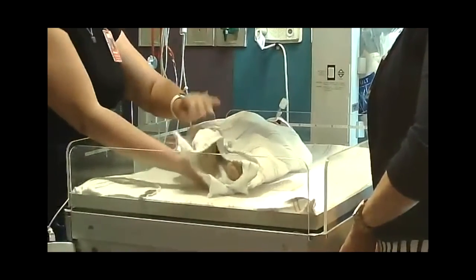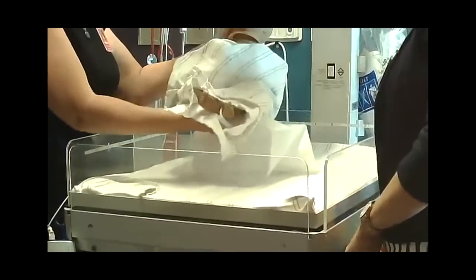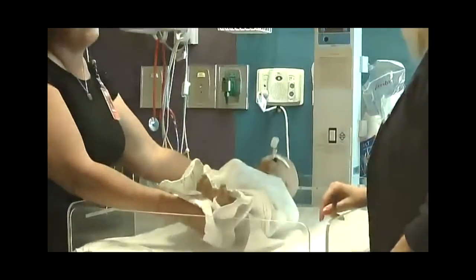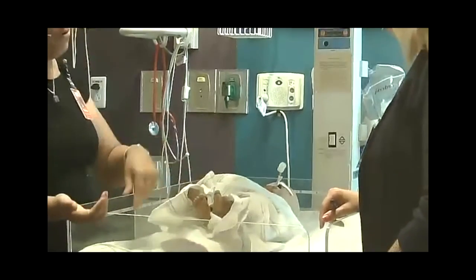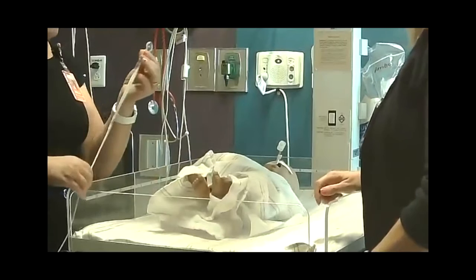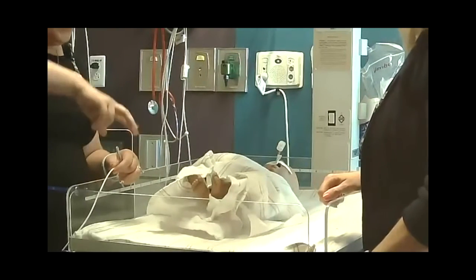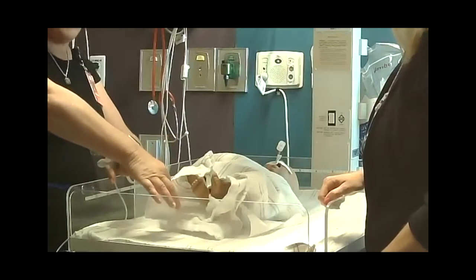So then you should be able to pick up. You always want to kind of scoop up. Does that make sense? And have things kind of lay, but not pull. So the biggest thing is not to pull, and things that can pull that are okay, remember. Sometimes we even have these little green clamps. You can use those to clamp and run stuff through them.